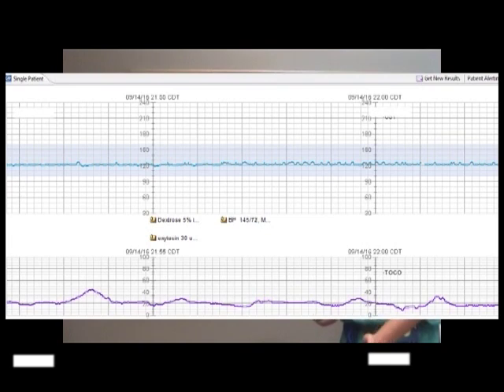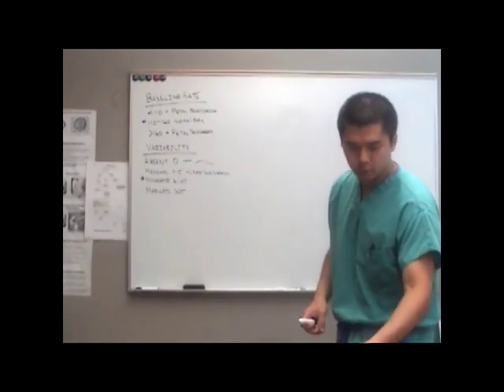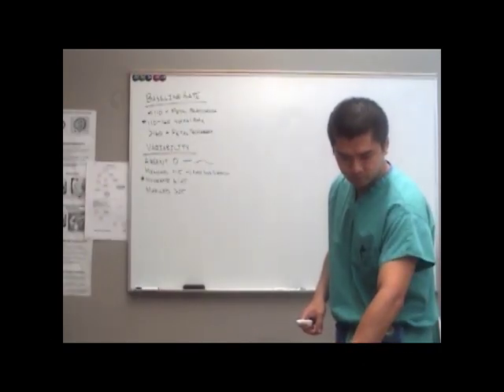But if you look at just the beginning, you're just looking at that first 2 to 3 minute window, it looks like there's minimal variability as the amplitude is not 0, but it's less than 6. It's less than half a box. So you can call this minimal variability, at least in the beginning.